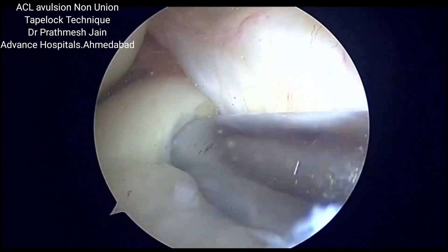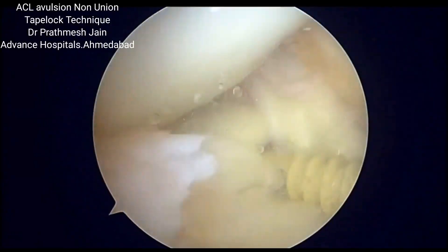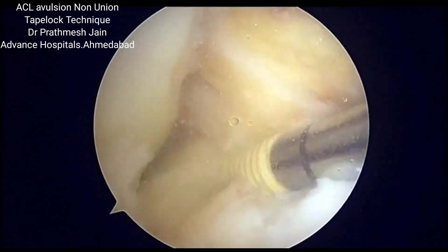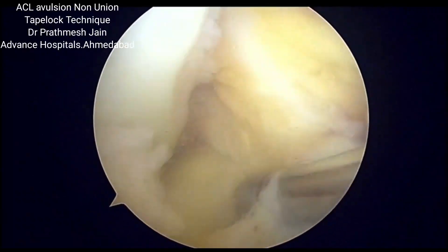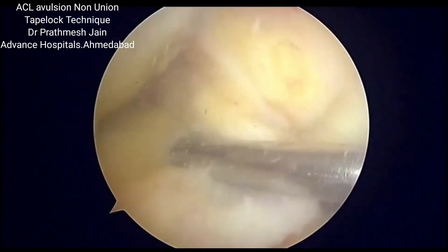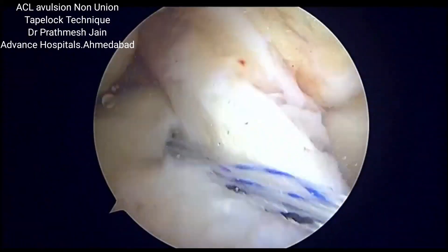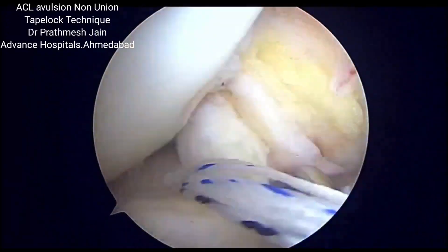The tape lock anchor is a special anchor — a 4.75 mm PEEK corticocancellous anchor which is inserted at the angle of the desired reduction. Once it is placed, it consists of two non-sliding tapes and one sliding fiber wire suture.